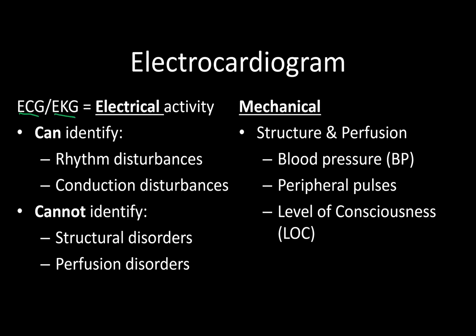Why does the K exist? Well, basically that's the Greek spelling. When they originally invented this, it was electrocardiogram with a K. Nowadays we use C for cardia, so hence the reason we use ECG. Either one is appropriate, they're pretty much interchangeable. For me, I use ECG to describe your normal telemetry stuff, what we do day to day, and reserve EKG for the 12 lead rhythms that we do there. Again, either one is appropriate, so you'll see me interchanging those throughout.